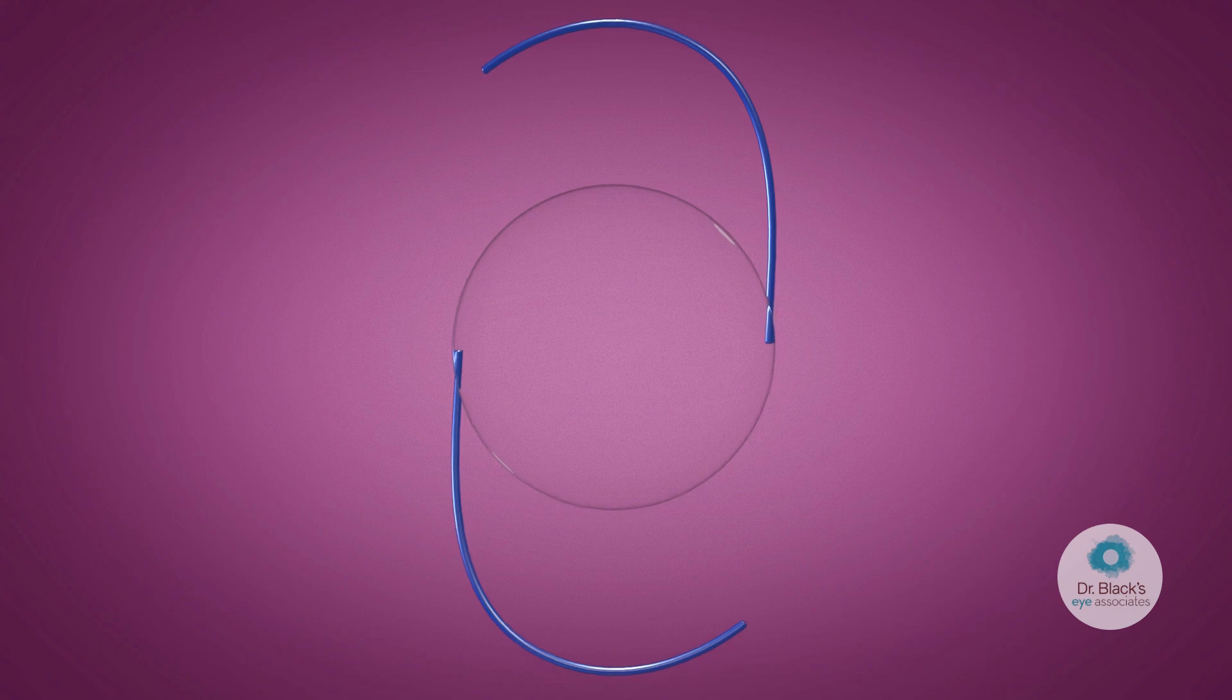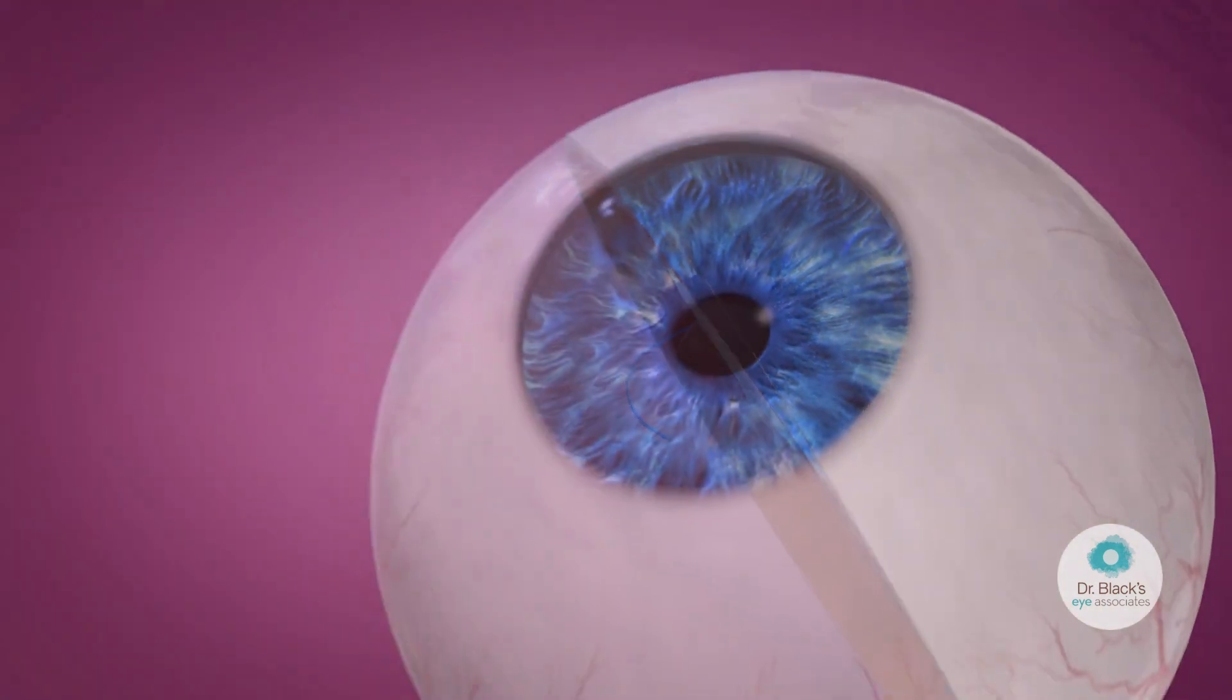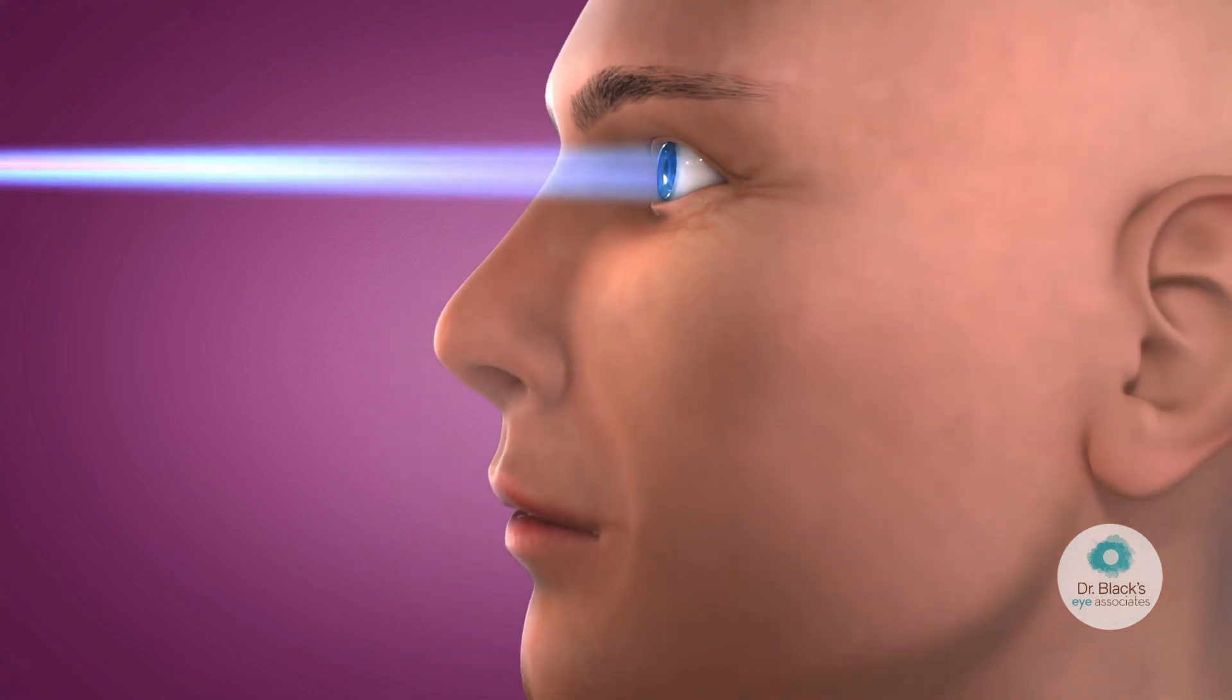RxSight's light-adjustable lens provides cataract surgeons with the ability to adjust the power of an intraocular lens after the lens has been implanted and the eye has healed, with an in-office light treatment that takes approximately 90 seconds.